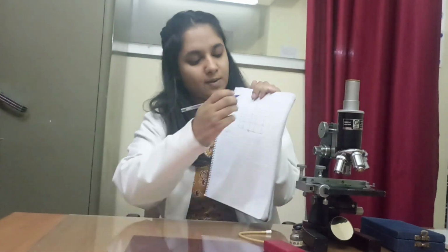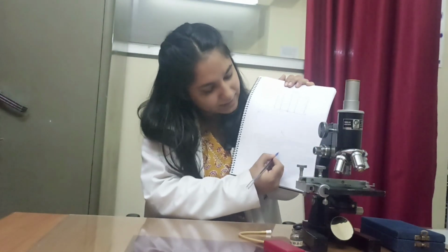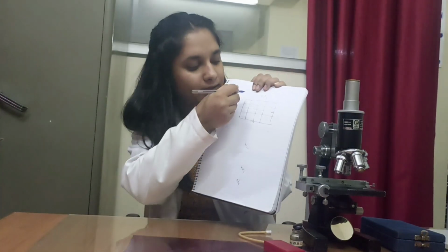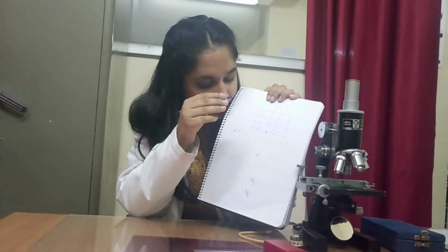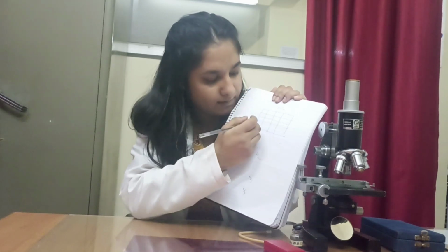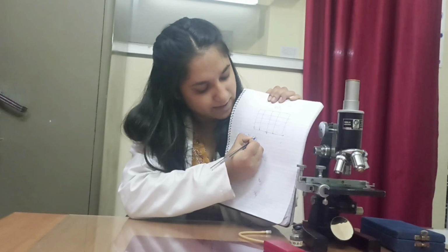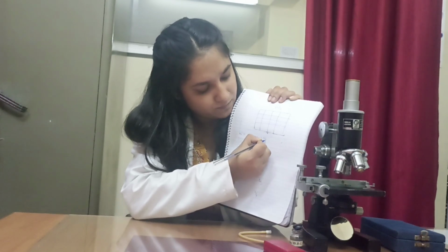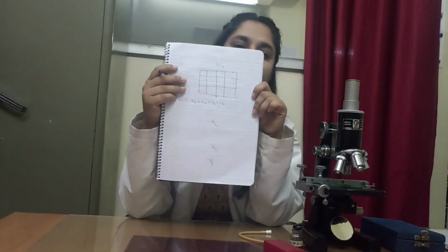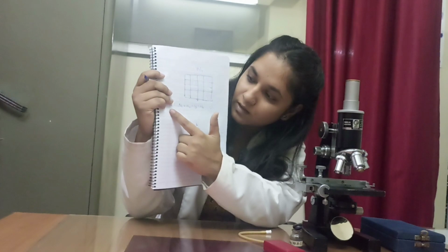And this chamber is denoted as n1, the second chamber is denoted as n2, the third is denoted as n3, and the fourth one is denoted as n4. Like this, we should denote the four chambers of WBCs. Then we calculate the overall WBCs in these chambers: n1, n2, n3, n4. We should calculate these four chambers in this way. N is equal to n1 plus n2 plus n3 plus n4.